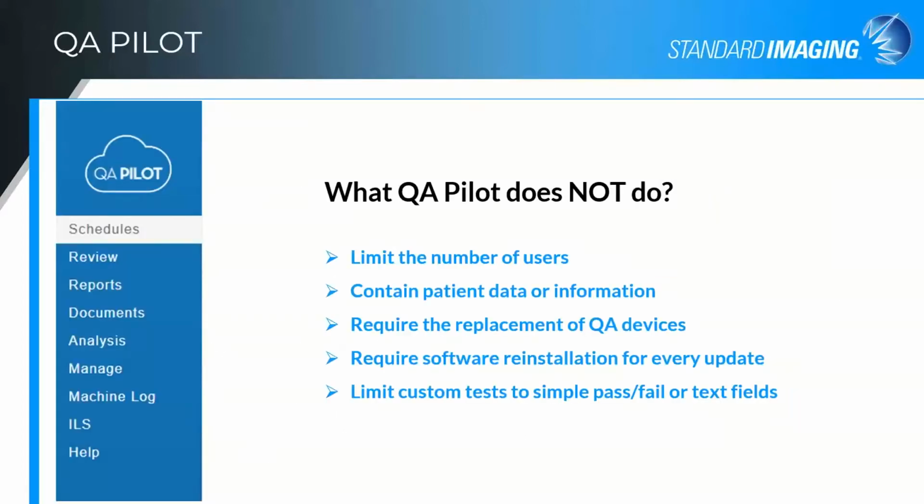It is also important to note what QA Pilot does not do in order to make management easier. It does not limit the number of users. The software does not contain any patient data. It does not require the replacement of QA devices in order to be able to integrate device data. It does not require software reinstallation every time there's an update, which is the beauty of the SaaS model. And it does not limit custom tests to simple pass, fail, or text fields.